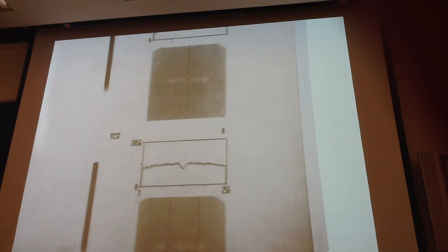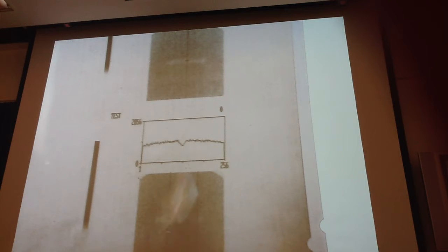or a low-pass filter. And if I wanted to sharpen this image up, then I would go to a high-pass filter, and that eliminates those long wavelength frequencies, and basically it would eliminate all of this, and all I would have would just be the edges of the object. So it would give me a much sharper definition.